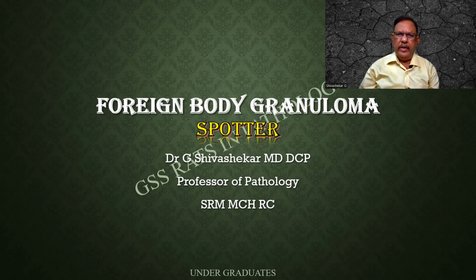They are aggressive in phagocytosis, but sometimes they get changed into epithelium-like cells, which are epithelioid cells. So you have got an epithelioid granuloma and a foreign body granuloma. Epithelioid granuloma with necrosis you shall see in tuberculosis. And a foreign body granuloma is this slide. Let us see what we have to identify.